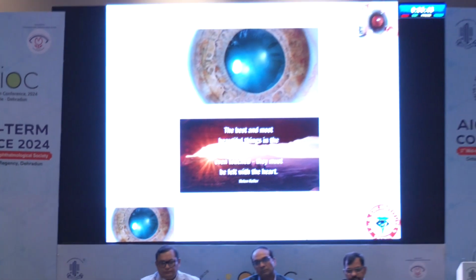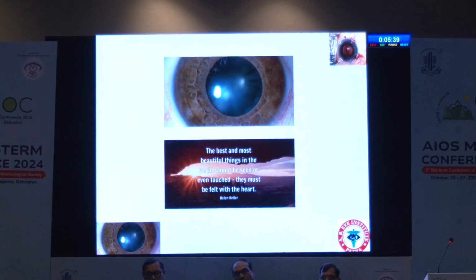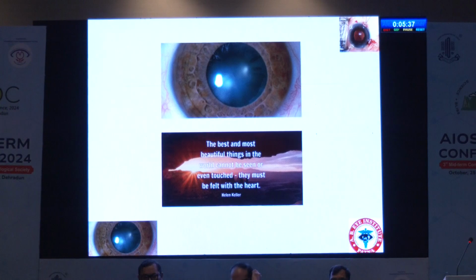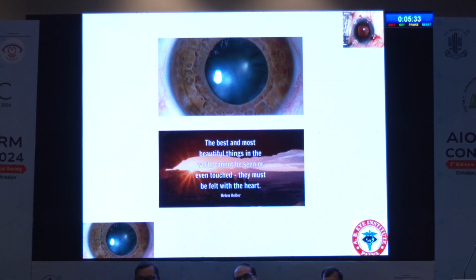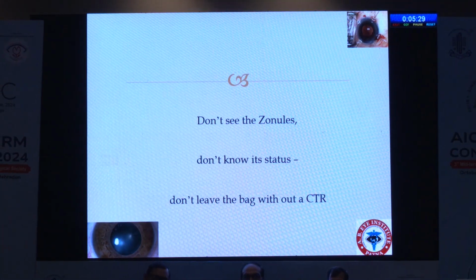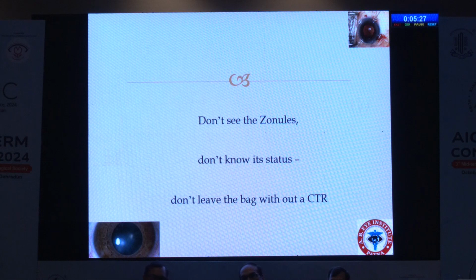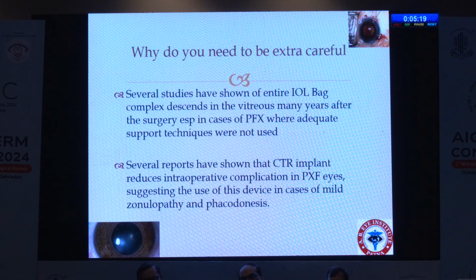The most beautiful things in the world cannot be seen and even touched. They must be felt with the heart. And what I am talking about is the zonules behind the iris which you cannot see. Especially in these cases of pseudoexfoliation, when you don't see the zonules and you are seeing the pseudoexfoliative material on the anterior capsule, on the iris margin, it is best to put a CTR in these patients.